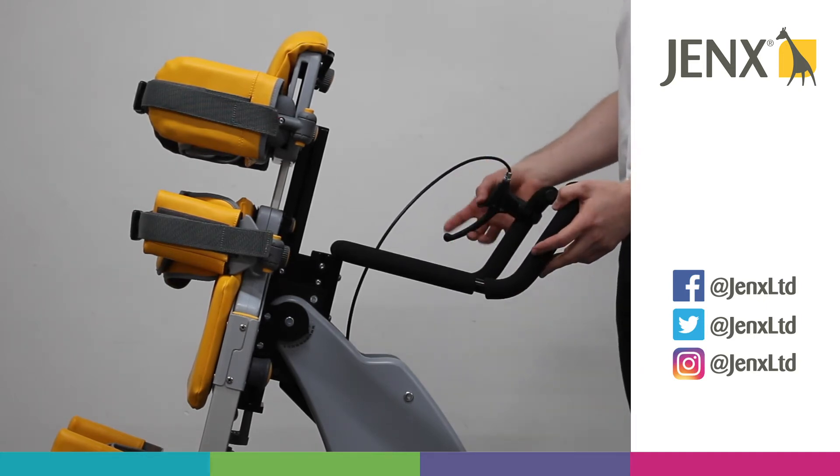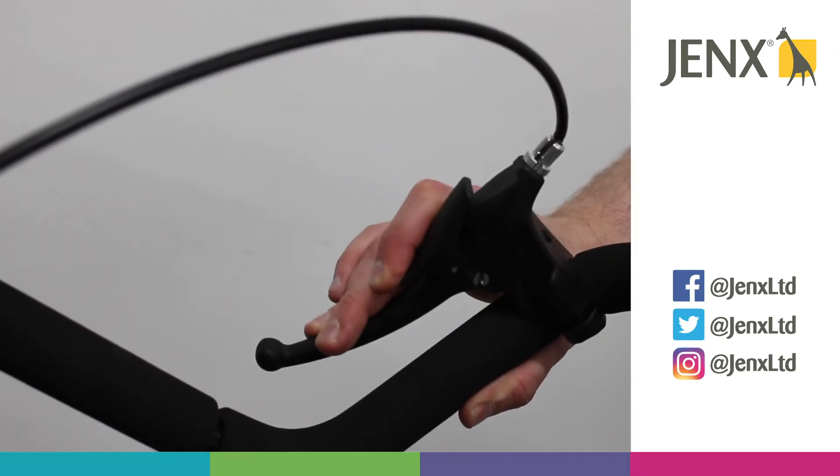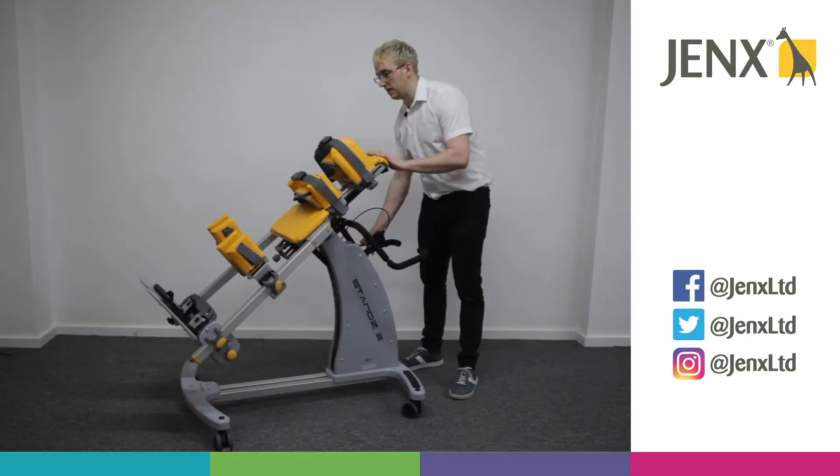To activate the cable release, simply press the lock and then press the handle itself, and that will activate the tilt.